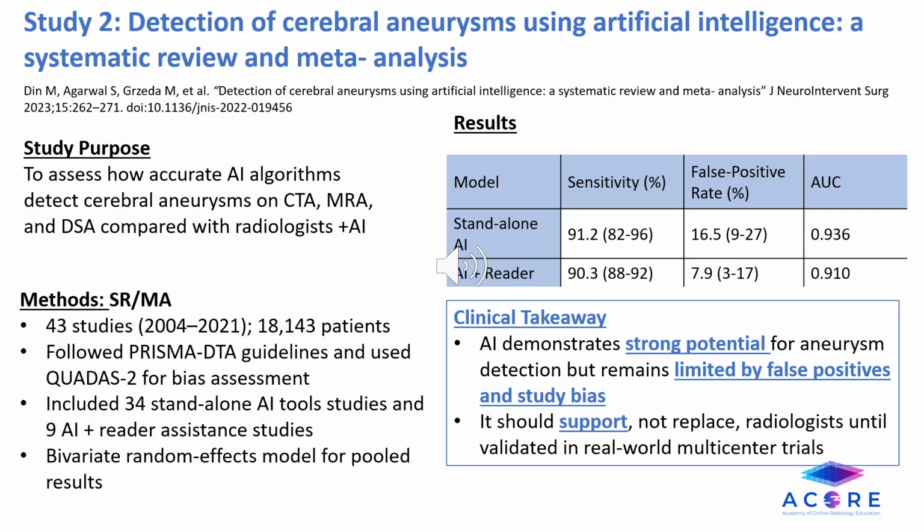So, the clinical takeaway here is that while AI has strong potential to support radiologists, it's not yet ready for routine use. The authors concluded that AI should function as a decision support tool, rather than a replacement, until large, multi-center, prospective studies confirm consistent real-world performance.